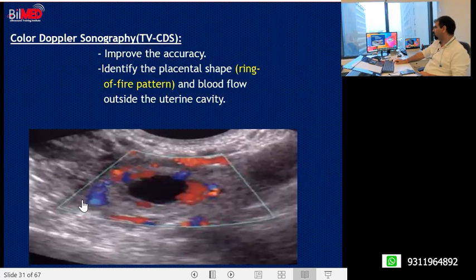Now see, the point is what I started with: I have to put each and everything in one basket. So now I am putting things in one basket. Then I will conclude whether it is ectopic or not ectopic. This is the point. You will be penning down these points in your notebooks.